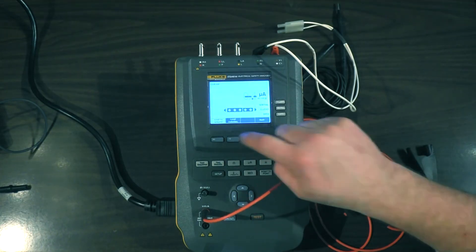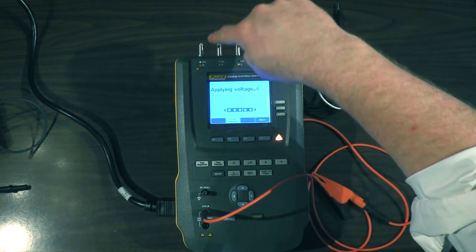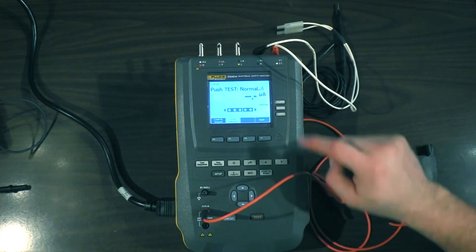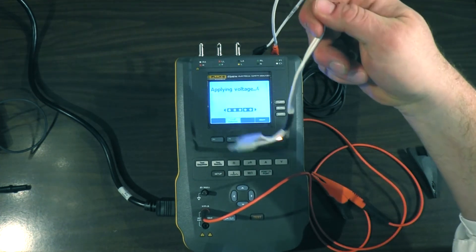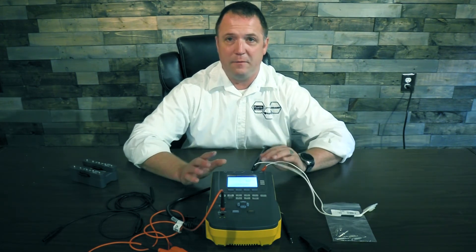That simply is the leads isolation or sink current test — however you want to phrase it. Go to that button — we're here on the three leads, so I'm going to push Test. 120 volts is going to come out of here through the ECG leads back into the power port — there's our leakage. And once again, over-arrow, Test — 120 volts out of the hands-free adapter port back to the defibrillator, and there's our results.